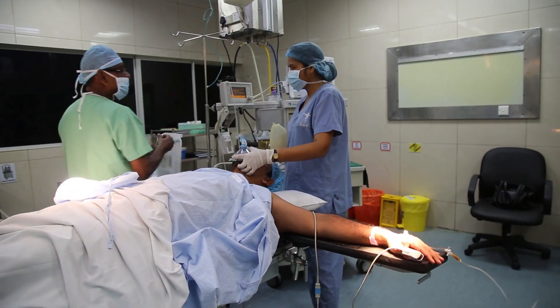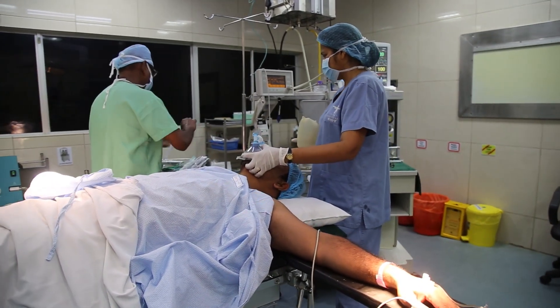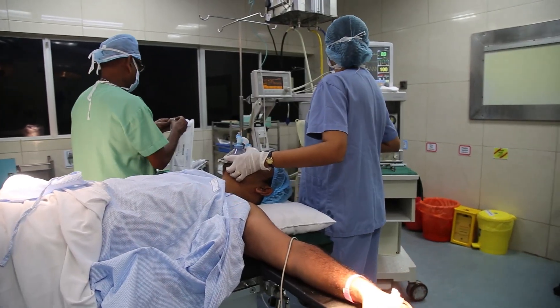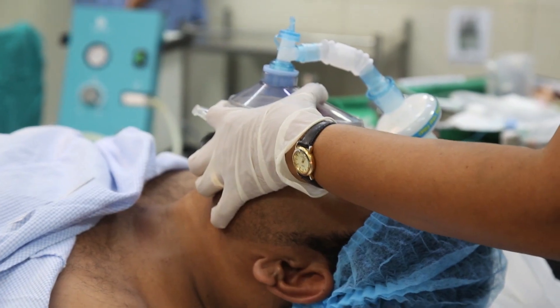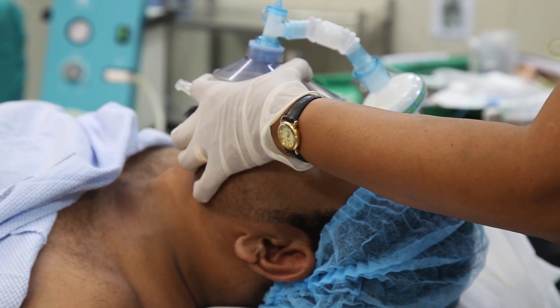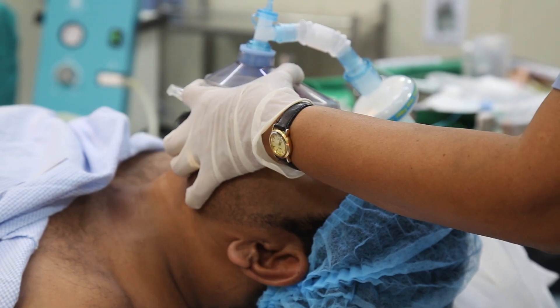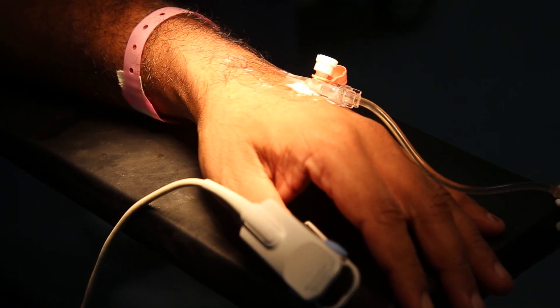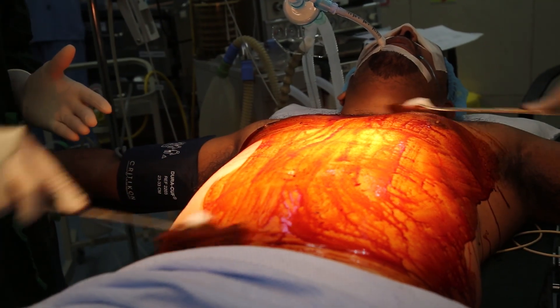This is a young adult in his 30s who wanted the prominent fat content in his anterior abdominal wall — the stomach area — above the waistline to be reduced. Generally this is a safe procedure done in a theater under general anesthesia, which is best for the patient to tackle all areas of the abdomen.